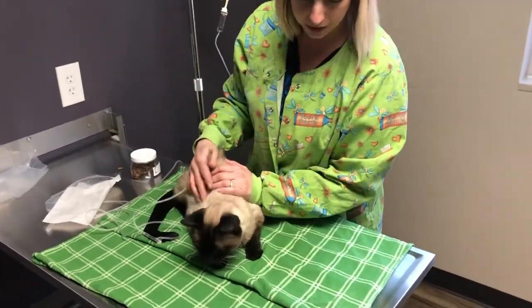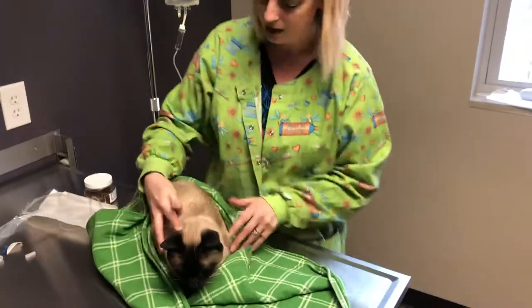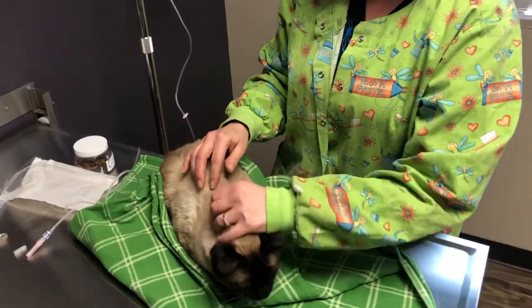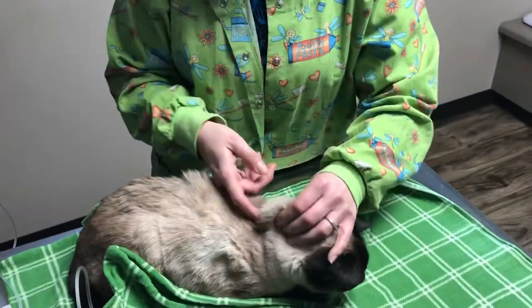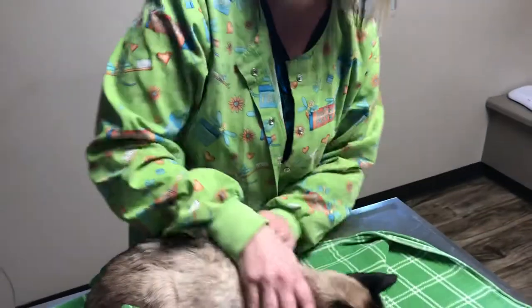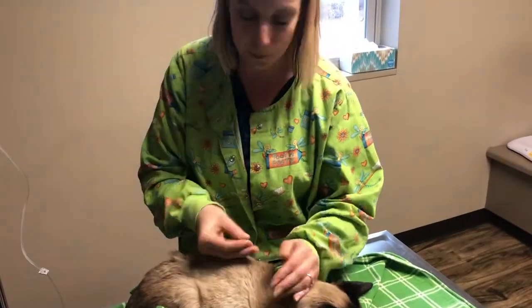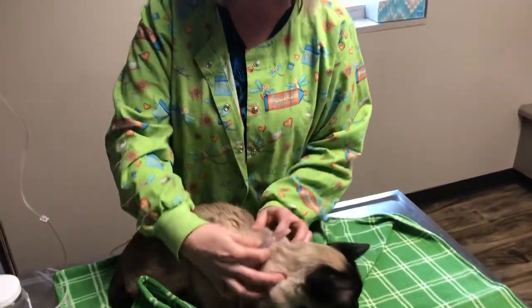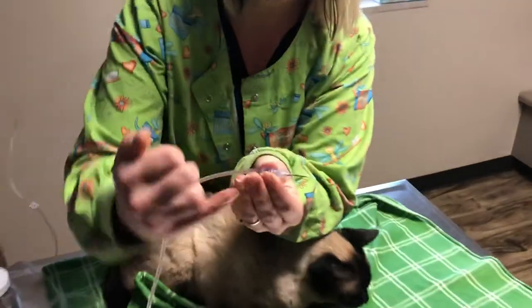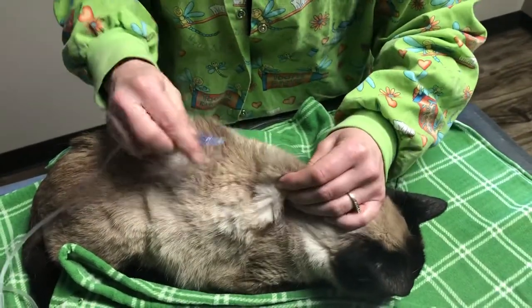Depending on the cat, Chico is really good for things. Sometimes you might have to wrap them into a little kitty burrito. The area we need is the skin, because we're going to go underneath it. You pull up on the looser area of skin, which is usually on the back of the neck, and make a little tent with your fingers. Right in that tent is where you put the needle through. It might take a couple of tries — if you go through and there's a little leaking, just pull back. I like to distract them; if they're eating well you can give treats. I do bevel side up, so the angled portion of the needle is where I go in, and I just go straight in.